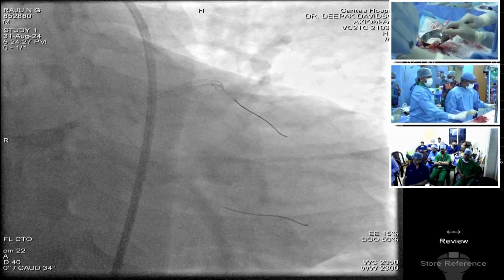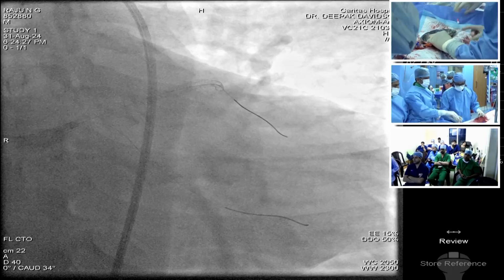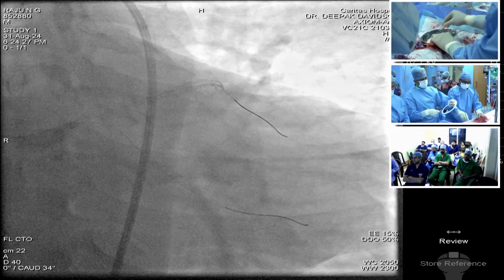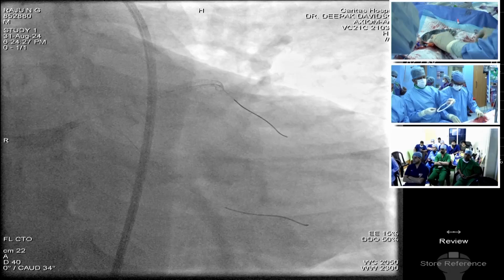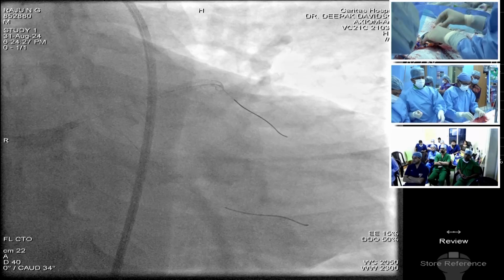This is the circumflex, that's the LAD. Okay. 3.25 into 12 for the LAD.